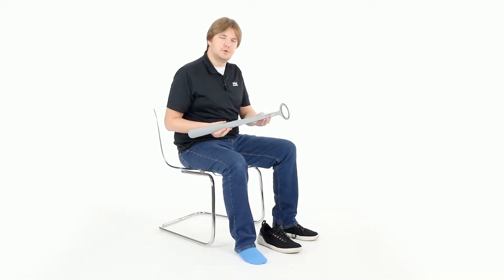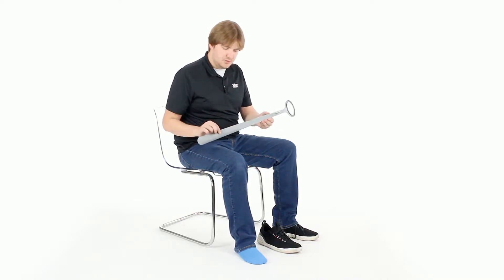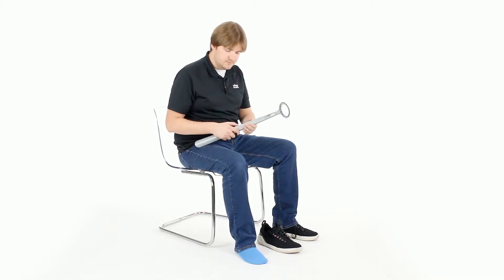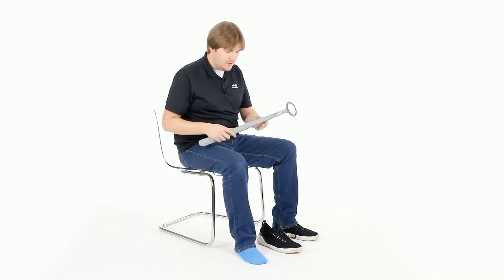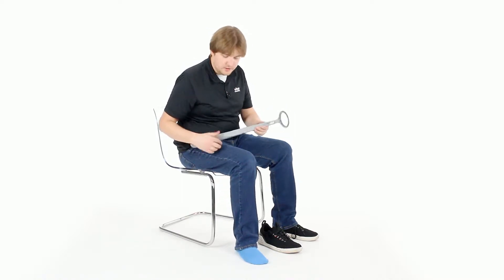Hi, this is Devon with Vive Health Customer Service with a quick tutorial on how to use a sock remover. The sock remover we have here is attached to our detachable shoehorn with sock remover. The shoehorn comes apart in the middle here, but for now we'll just worry about this little sock remover hook here.